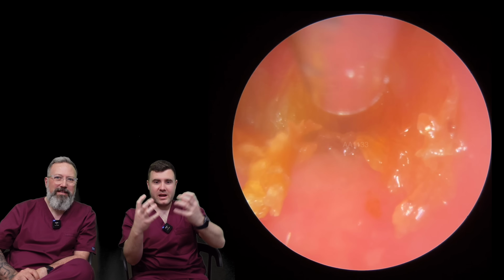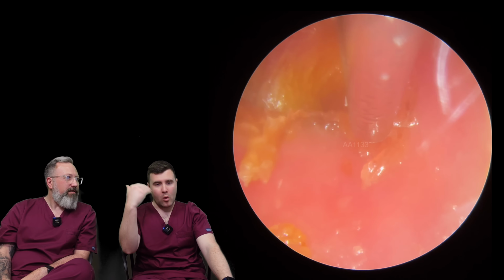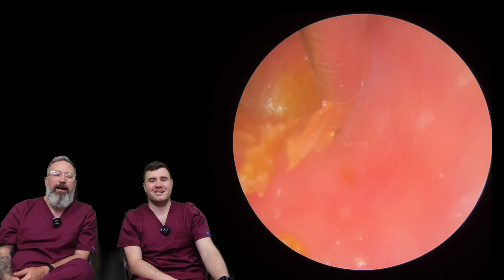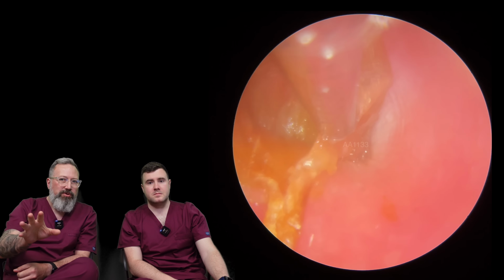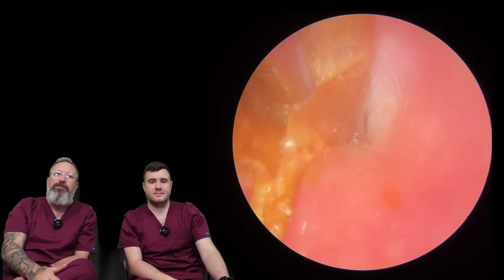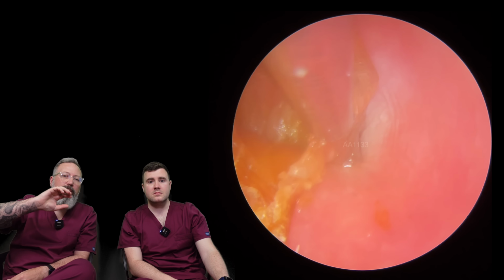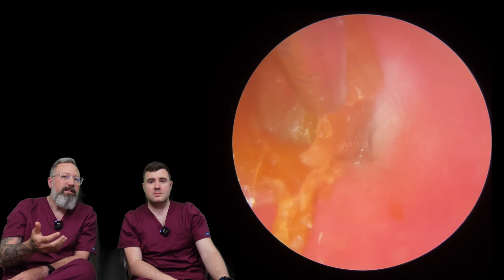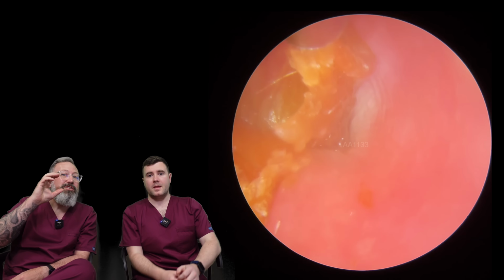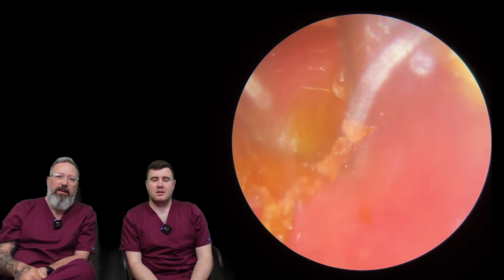Yeah. And it's really holding on, isn't it? It's like connected to the eardrum, the walls of the canal. Yeah, it's everywhere. Basically the gent's got some other issues going on, which obviously we can't elaborate on, patient confidentiality. But it means that when we talk about epithelial migration, it really doesn't happen particularly well in this patient. So instead of the surface layer of skin coming away from the eardrum, it's actually sitting and hardening in place, which means it's really difficult to get this out.